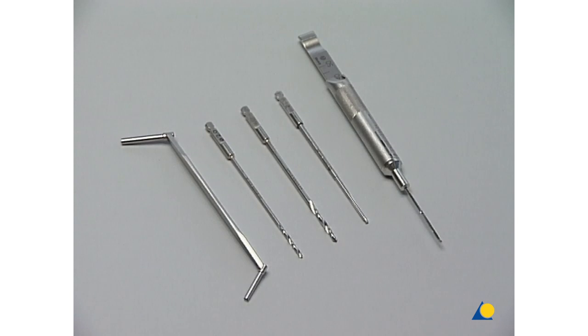The same model will be used for fixing the fractured lateral process of the talus. We need this selection of instruments for the 2.7mm cortex screws.